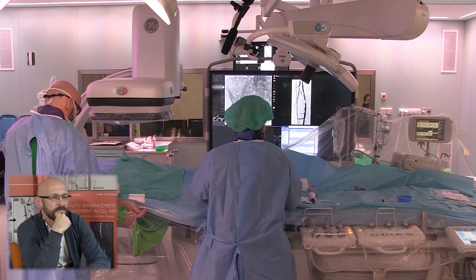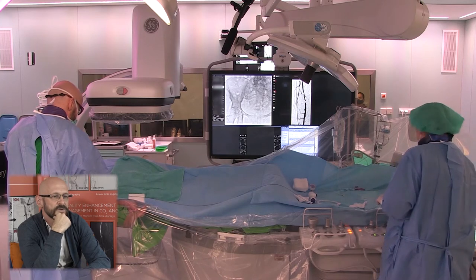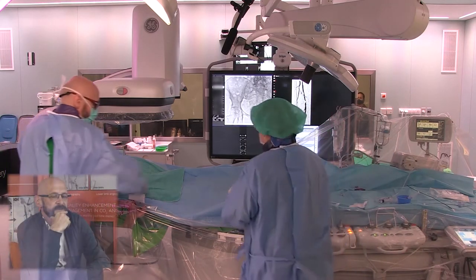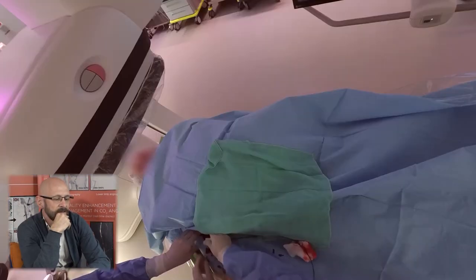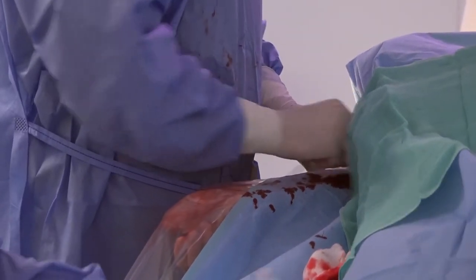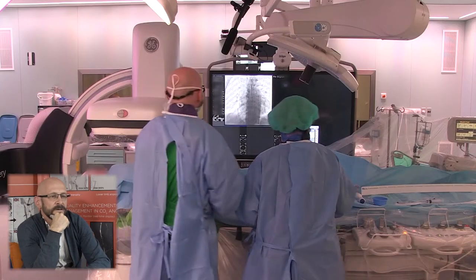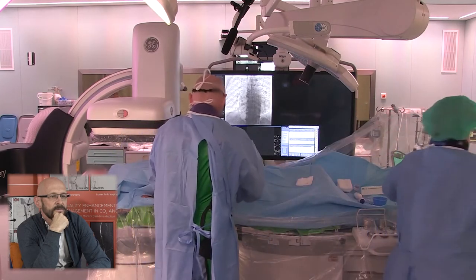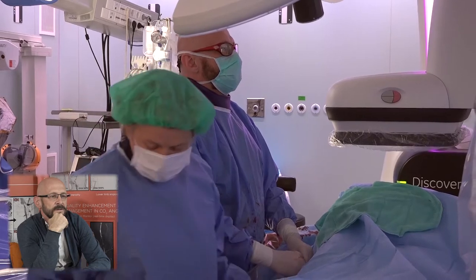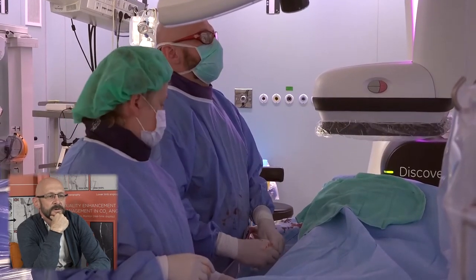This is the first step: getting access through the right brachial artery. We didn't use ultrasound in this case — the patient had a very good palpable pulsation at the brachial artery. First we introduced the pigtail catheter just to engage the descending aorta, and we used the long hydrophilic Terumo wire, which was advanced into the descending aorta.